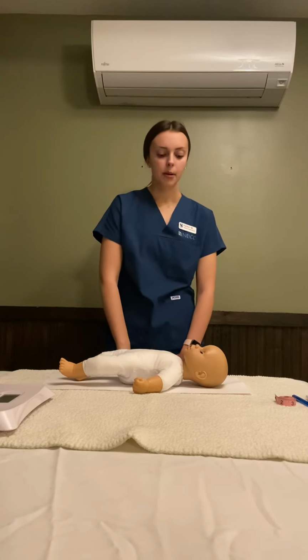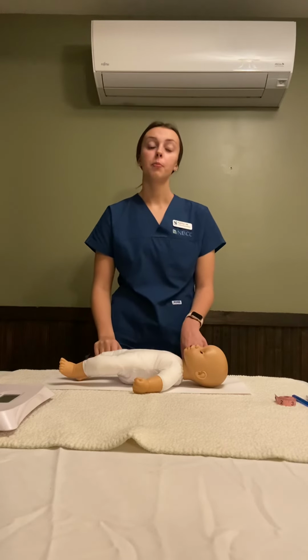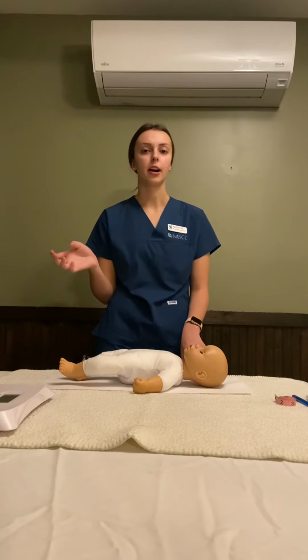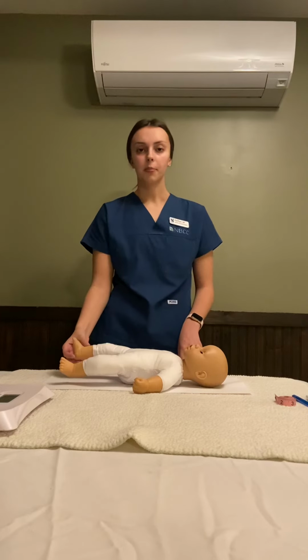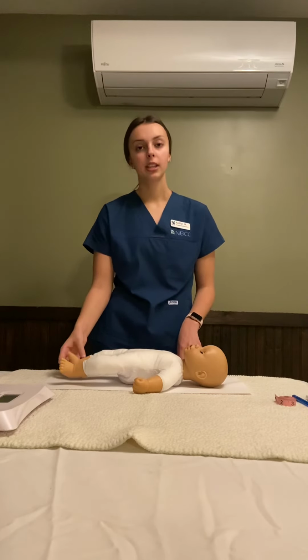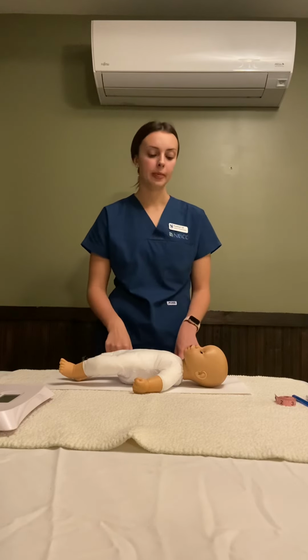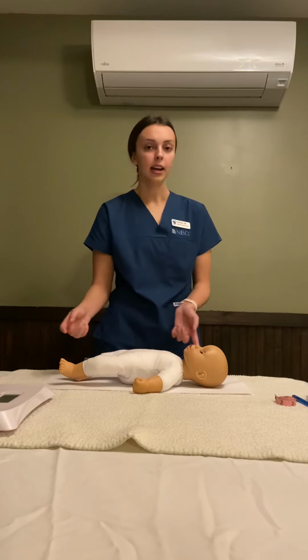So after that, I'm going to do the bilirubin reading, which is a little test to see if the bilirubin levels are high or low. If they were low, that's okay, that's good. But if they were high, you have to get the baby's heel pricked to see what the actual level of bilirubin was. And then I'm going to assess the neck and for a head lag.